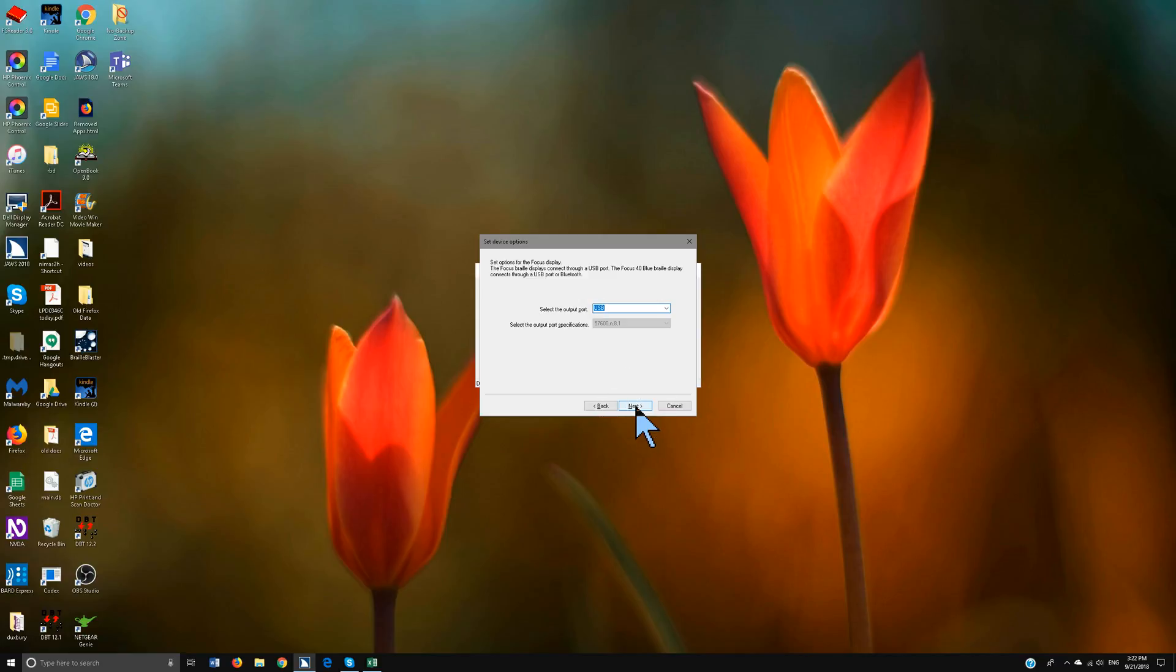Now if you want to do Bluetooth you're going to have to go more steps on your Bluetooth but if you want to just plug it in it's USB. So for ease right now if you're a beginner setting this up just plug it into your computer with USB and hit alt N for next.